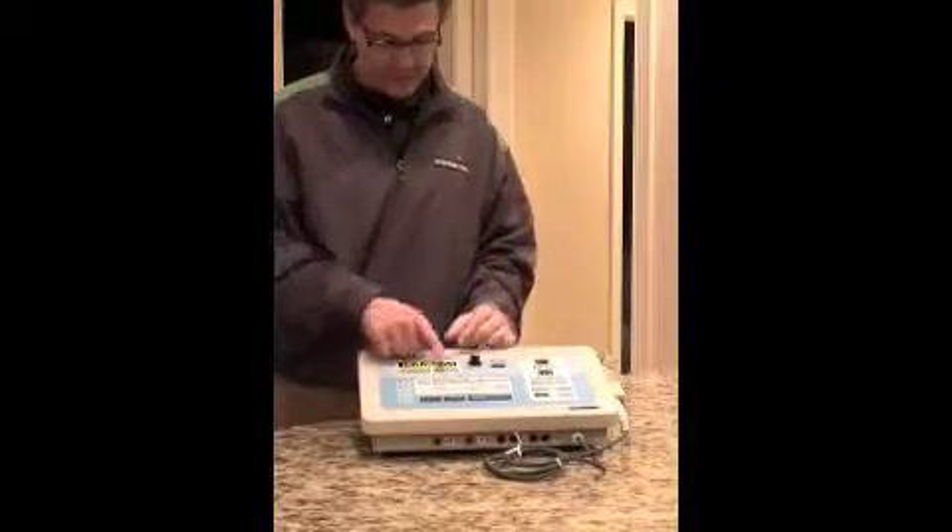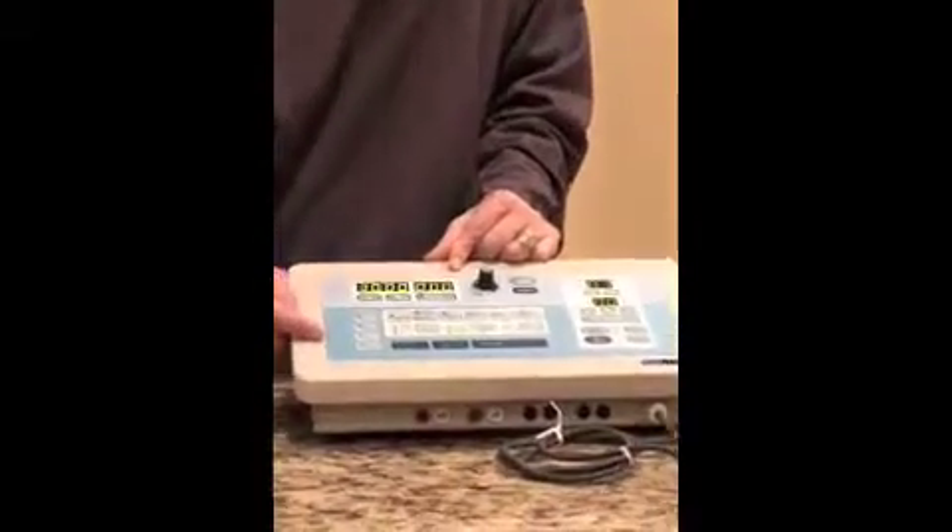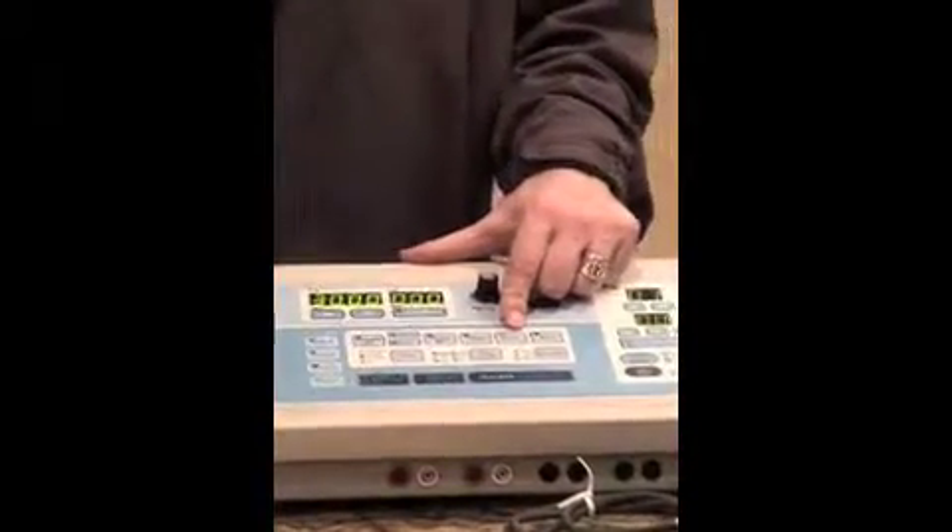Profile C comes from the factory as another pre-modulated setting with different parameters, and profile D comes preset as high volt. This is the end of part one of the Richmar CM2 in-service — please go to part two.